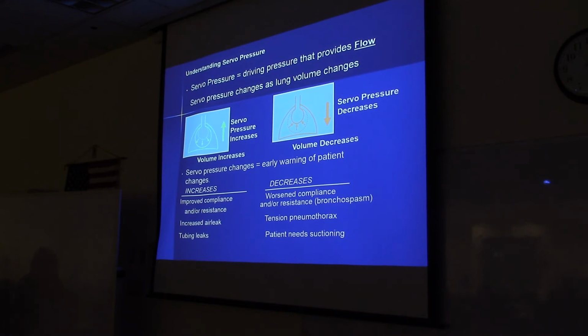It's just monitoring how hard the motor's working to ventilate a lung. And when the motor's not working very hard, it's not ventilating much lung. And then the opposite can be true also.